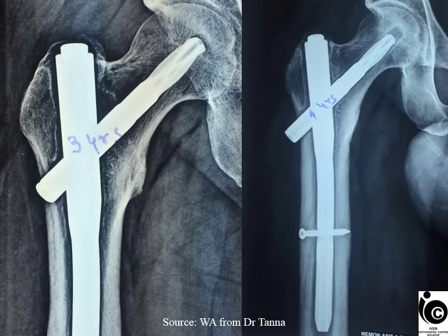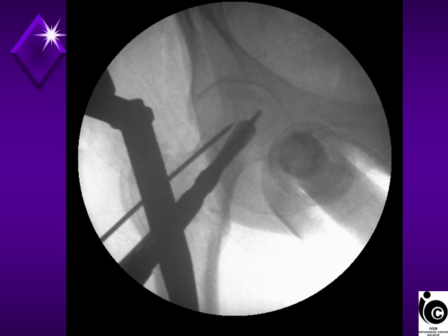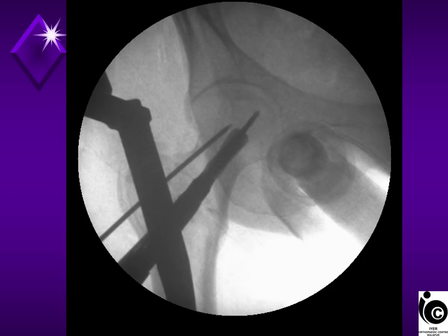Even though the fracture unites, many a time the nail has broken inside a united fracture subsequently. I have seen a few cases. So there is always micro motion and stress and strain over the implant, even on a united fracture. Again, this is with the helical blade open and this is closed. The helical blade has come back. That indicates that it has lost the purchase it had in the head.